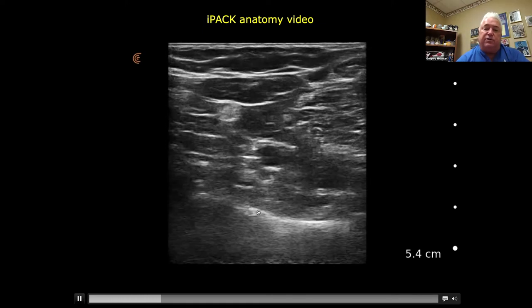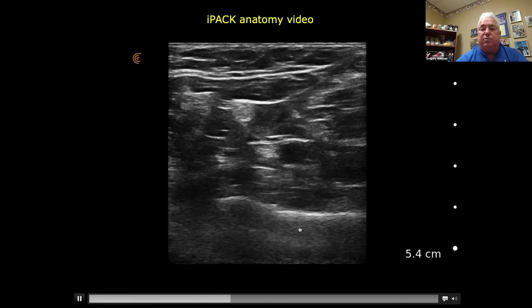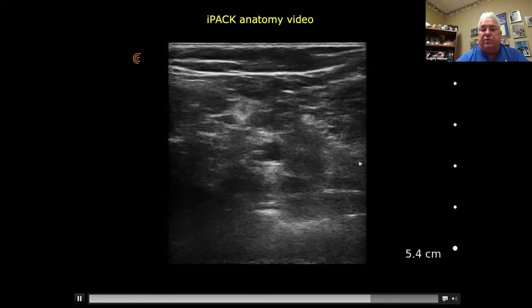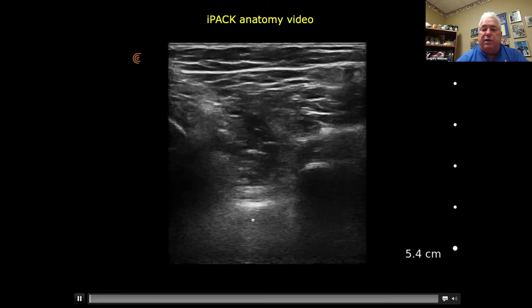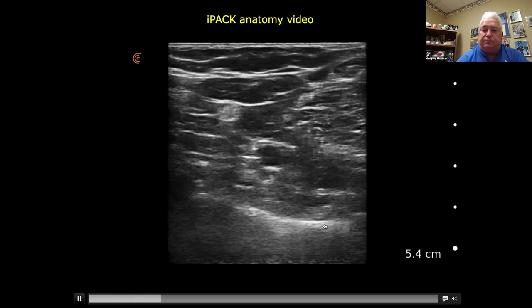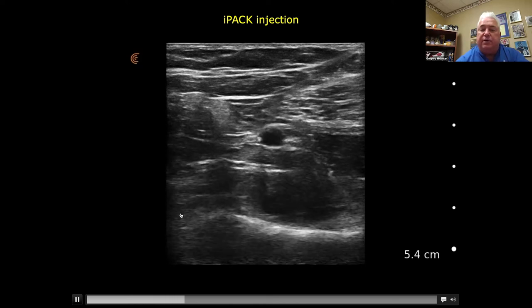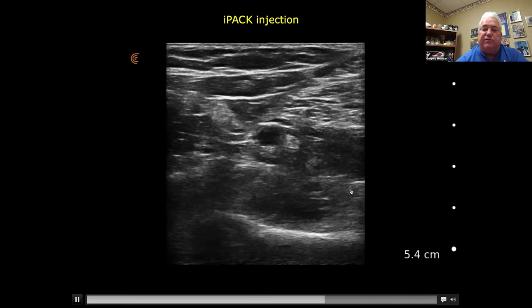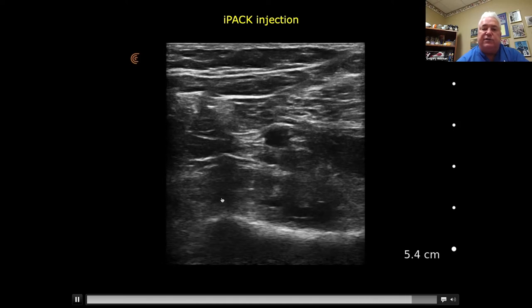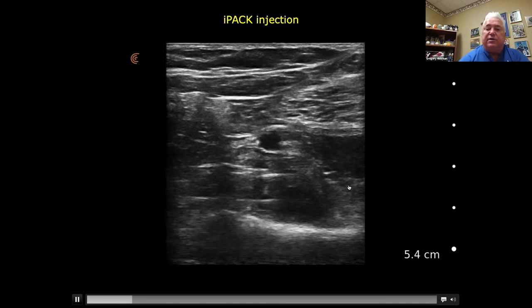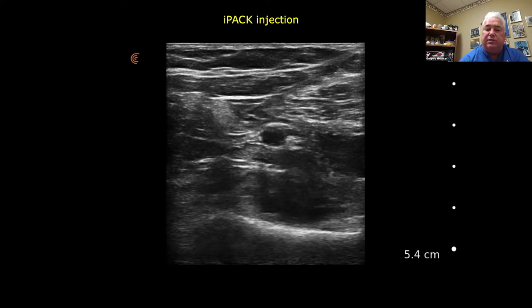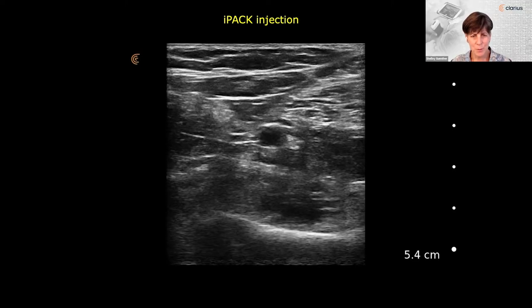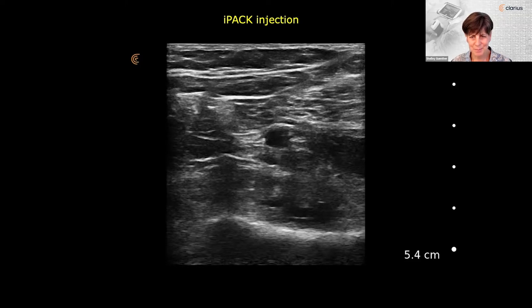In the video, you first see the condyles of the femur, then slide proximally to get the flat femur where we have space to inject. Here's our injection — the needle coming in from left to right, injecting in this area between the bone and the artery. We'll put five cc's here, five here, and five here. Usually 15 to 20 cc's is what we use for the IPAC block. You can see my needle more easily than with Dr. Sina's approach — that's the reason I like it. You also seem to have a little bit more real estate to work in there behind the artery.